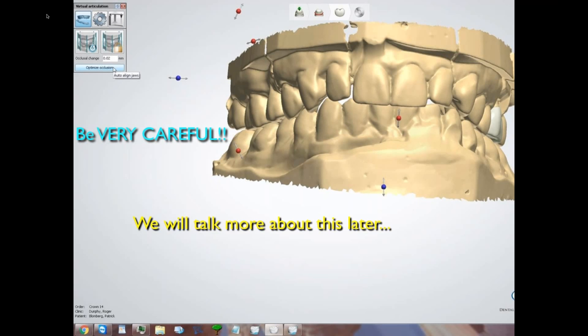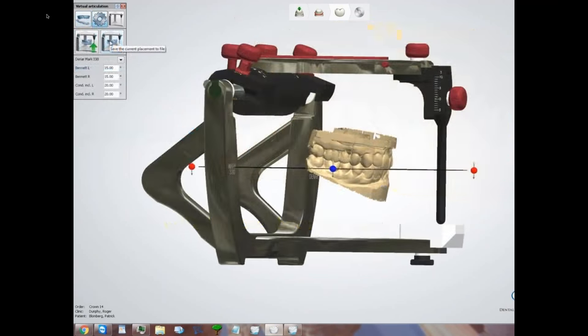I don't really like Optimize Occlusion a lot, although it has a place. When we go into the setup page, we see two icons in the middle: one that saves the current placement to file, and another that performs an auto placement within the articulator — which is extremely important once we understand what it really does.